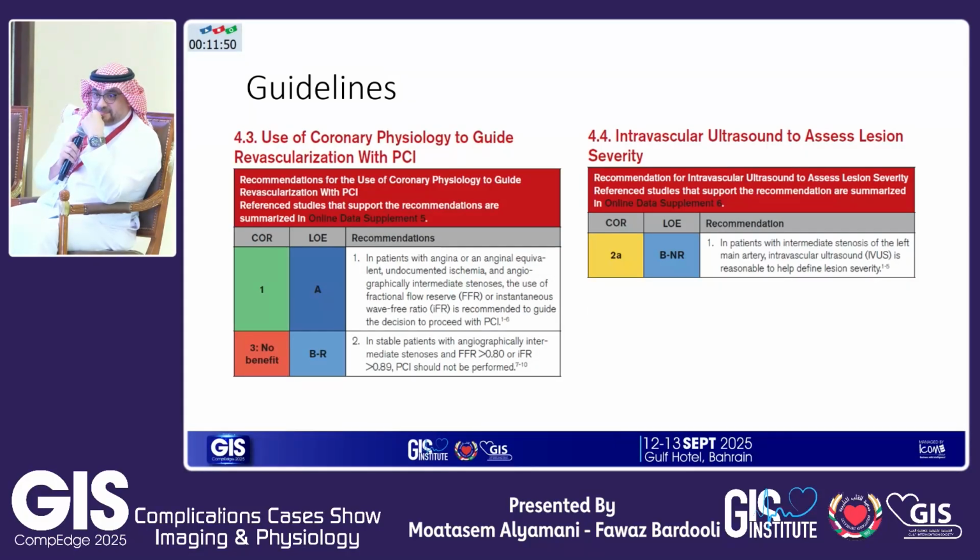And in this case, even if this left main by IVUS is significant, will you send the patient to surgery? Because the surgeon will ask now, shall I graft that circ or not? Yes. This will be again another point. And this is the debate to revascularize or not, actually. That's the main debate now. Can I make a point?